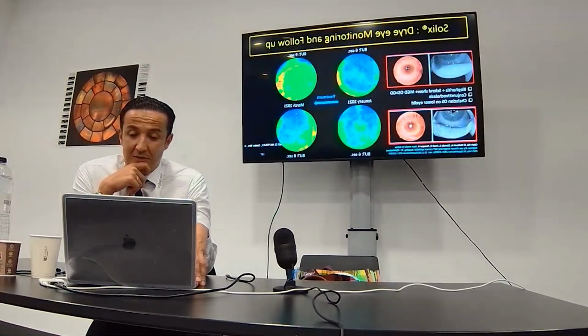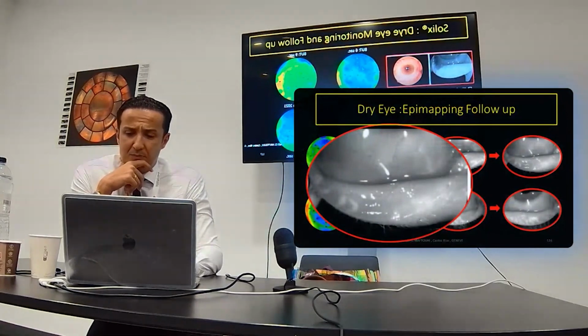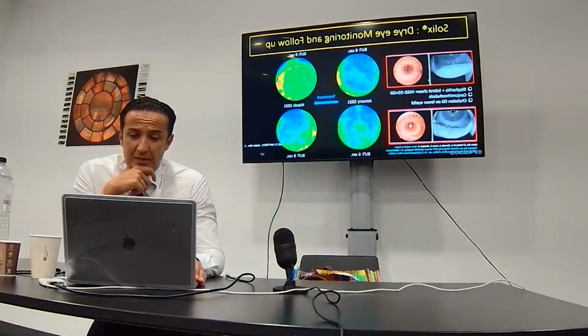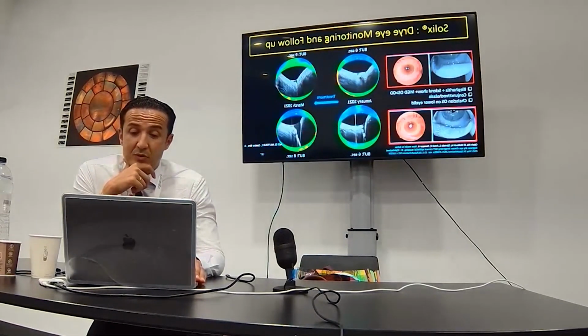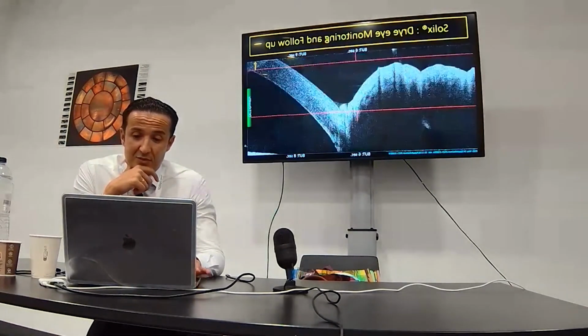Another case of a more advanced stage of dry eye. And look here, with the incomplete blinking, scleral show, chalazion. This is before and after the treatment. And look here, we also observe a reduction of the folds of conjunctivochalasis after the treatment.